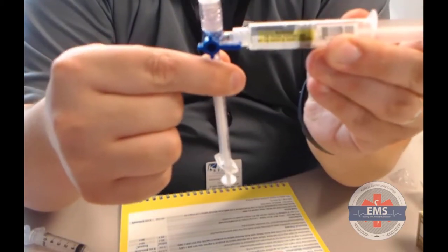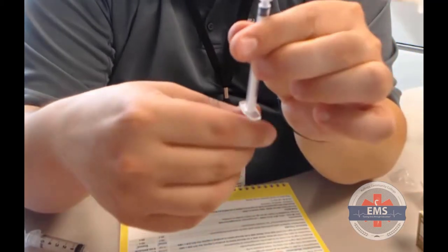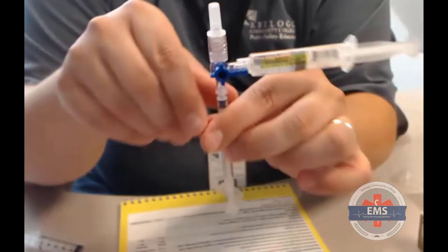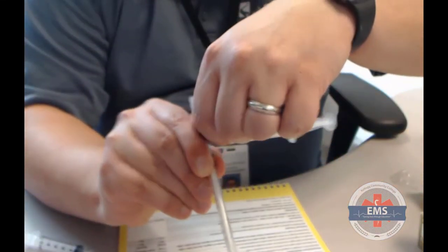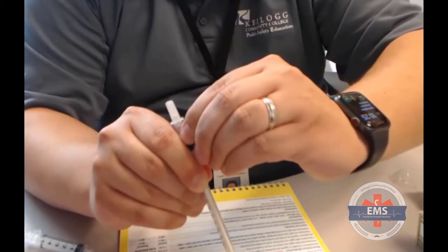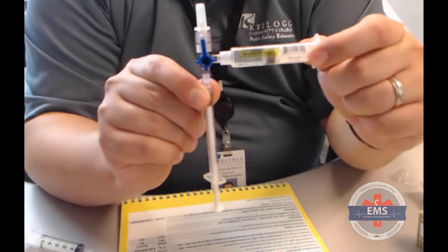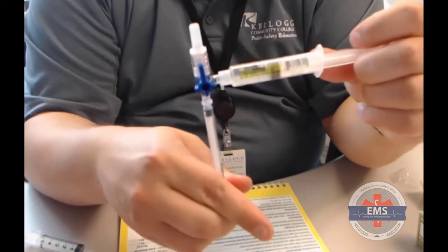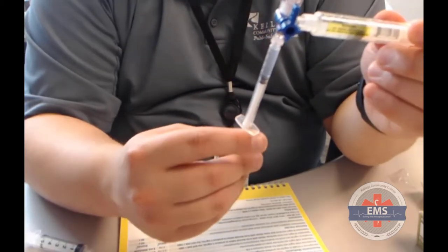If I try to push this, as you can see, it won't actually go. If I try to pull this down, it's going to be able to pull some air, but it's pulling air from here. Okay. Now I'm going to turn this off to the part that I'm not going to be utilizing, which is going to be up here. Now as I go to push fluid, you can see the syringe will go in any direction that I push it. So I'm going to slowly start to draw up.